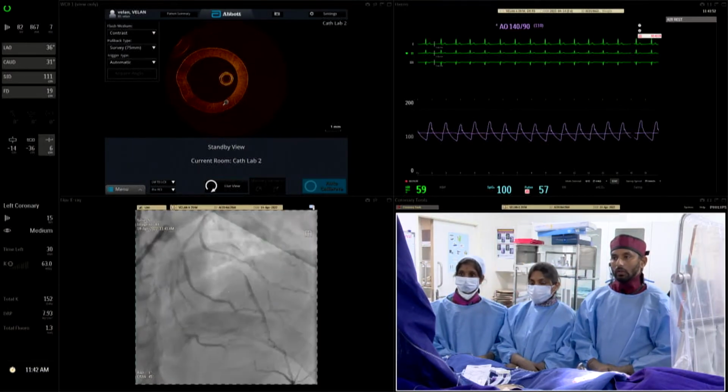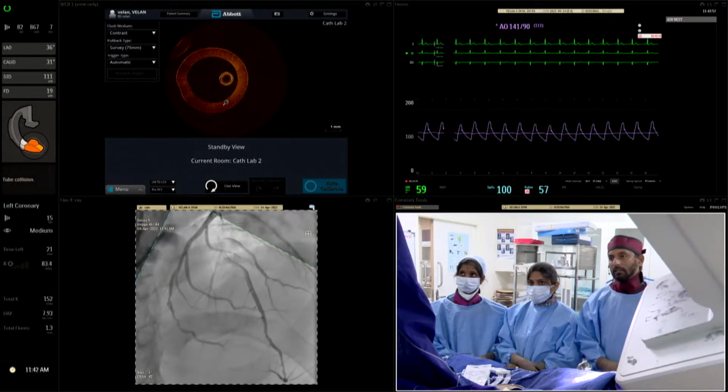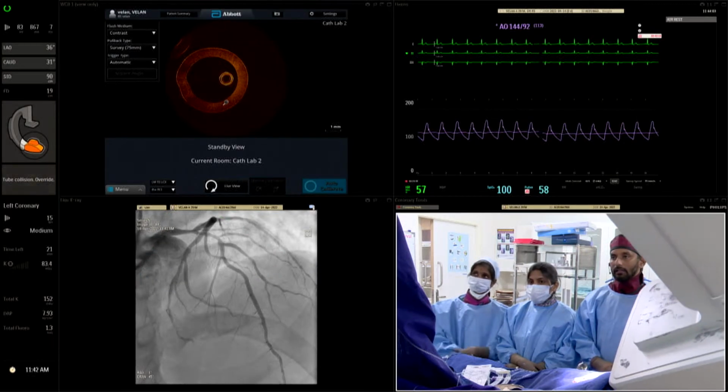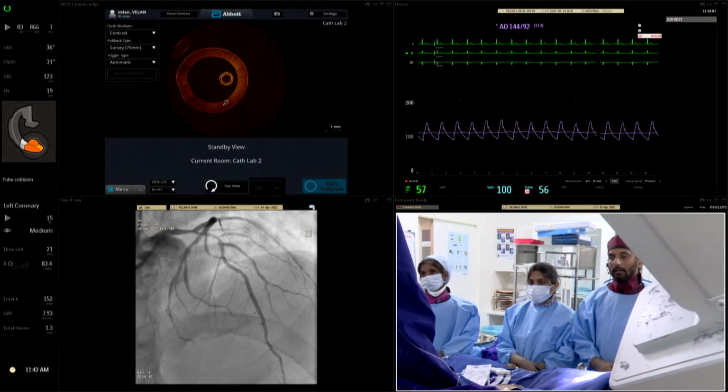As you know, we always see some differences between the angiogram and the pictures we take during the angioplasty with the larger guiding catheters. One of the things I noticed is that the LAD seems to be not too bad after a diagonal branch.